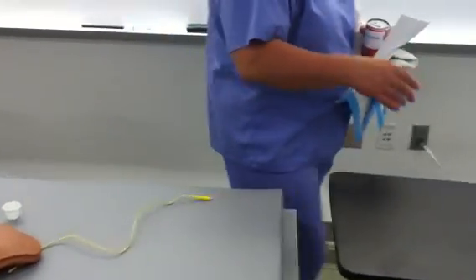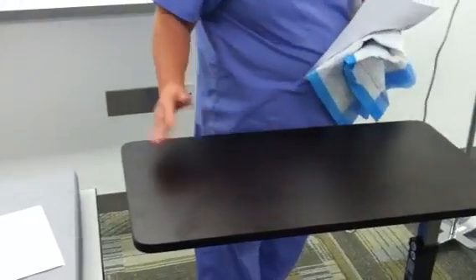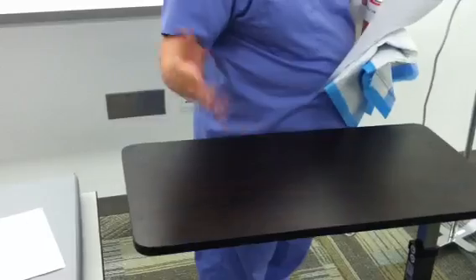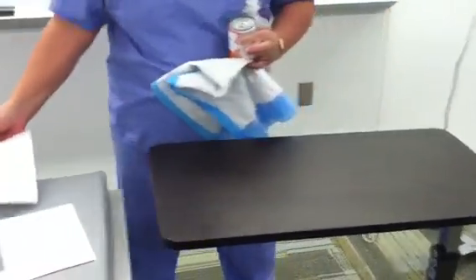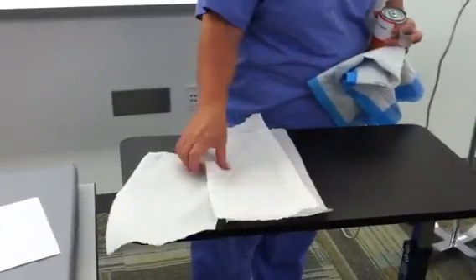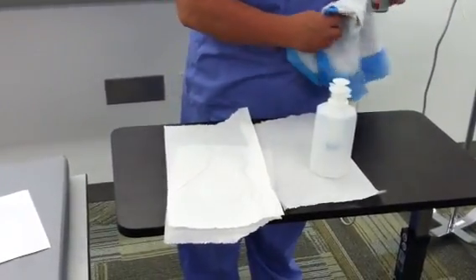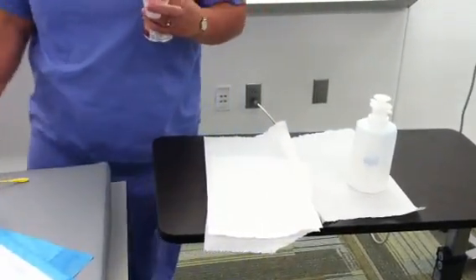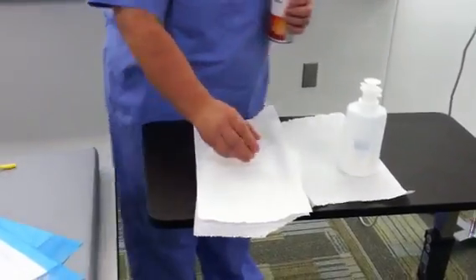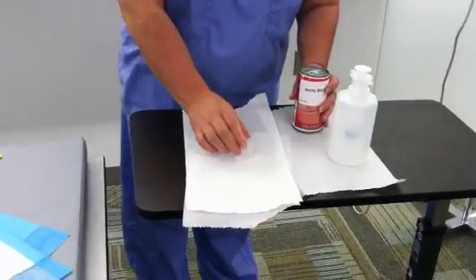Okay, so then I'm going to go into the patient room, and I'm going to clean off the bedside table. I might need to clean it with soap and water or an antibacterial equipment cleaner that might be available in the restroom. And I'm going to set my stuff down. I'm going to set some paper towels out, and I'm going to set everything on there. This is my clothing protector for the patient. I'm going to have my medicines. I'm going to have my formula. Well, I think I'll give the medicines first and then the formula.